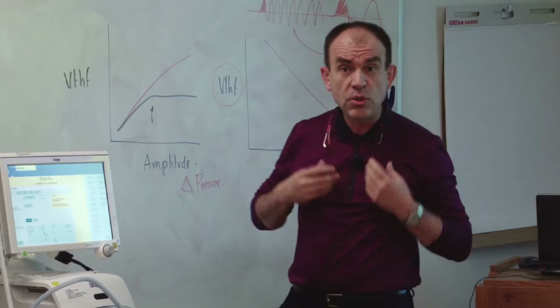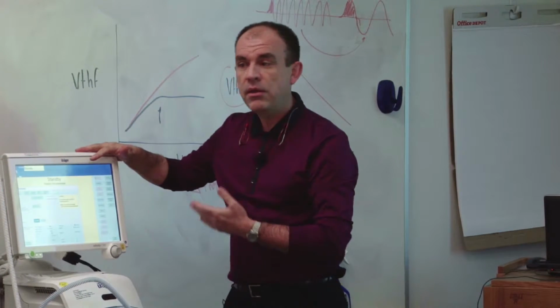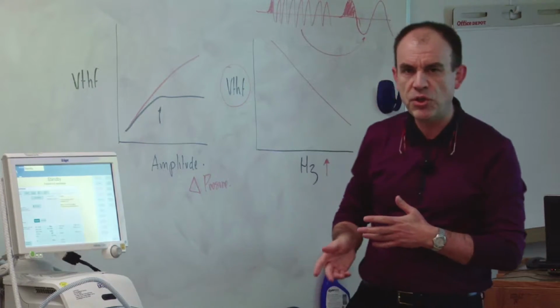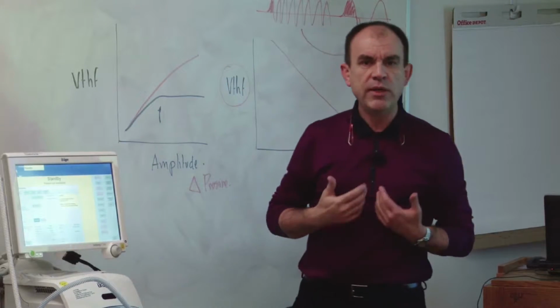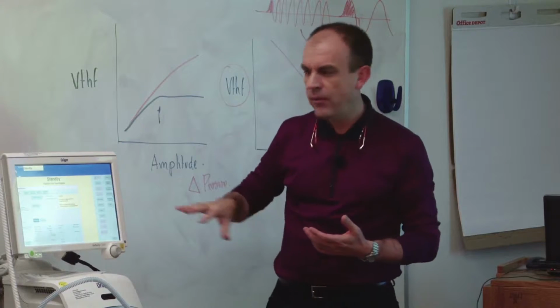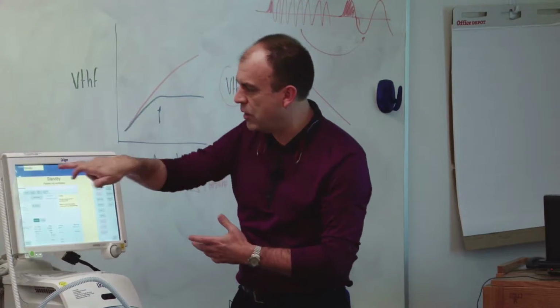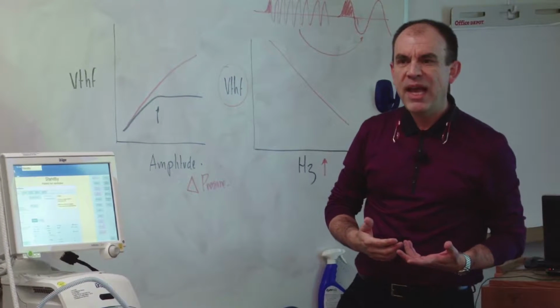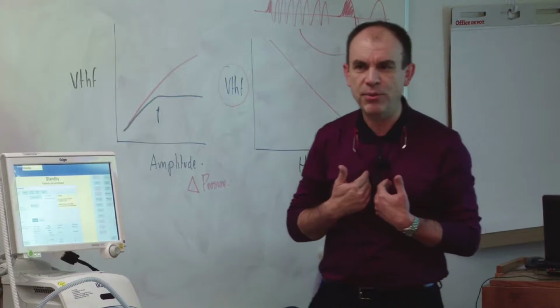One of the things that I wanted to show you, and we talked about yesterday, is that what we usually do as a protocol before setting up the VN500 independently, whether it's for high frequency or conventional, is we calibrate the screen. And why do we do that? Because after a while, tactile screens can get offset a little bit, and you start touching things, and they don't actually respond. And that can be very annoying in a critical patient, and it's happened to me.